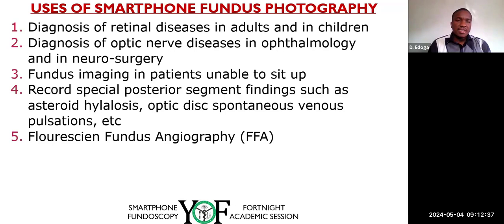Then it has come up, sometimes when I'm on call and I'm asked to examine a patient and do a fundoscopy. So for instance, maybe cancer patients that are so sick that they cannot even sit up. With smartphone fundus photography, we can actually image the retina and image some of the signs of cancer retinopathy. Then the other one is to record special posterior segment findings like asteroid hyalosis, spontaneous optic disc venous pulsations. I'm going to show you one that I recorded 2 days ago.